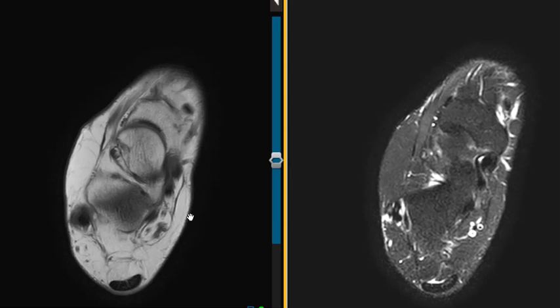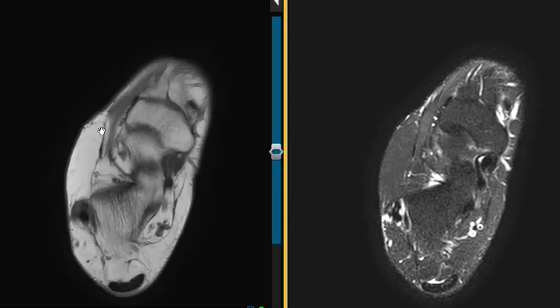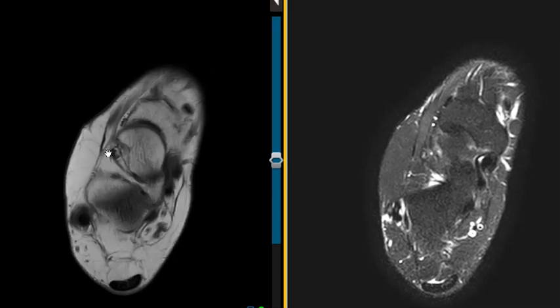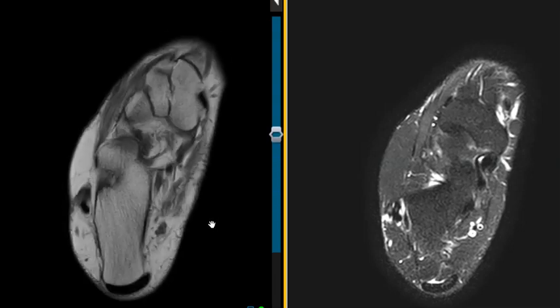Sometimes people will feel a little bump, and it's hard to know, is this just an asymmetric fatty collection like this? You can see the subcutaneous fat here really thin, underlying muscle, and we come over here and all of a sudden, whoa, this big collection of fat that's fairly clean. And along on the medial side, they had another collection like this. Let me come on down.